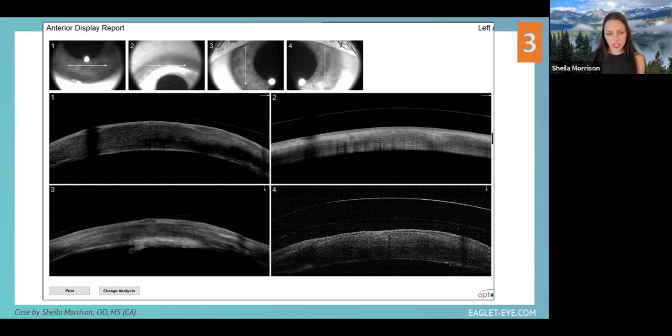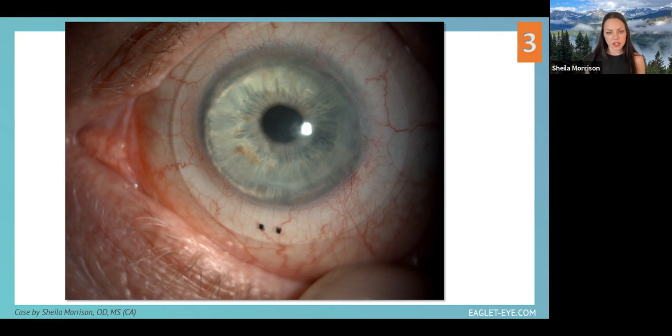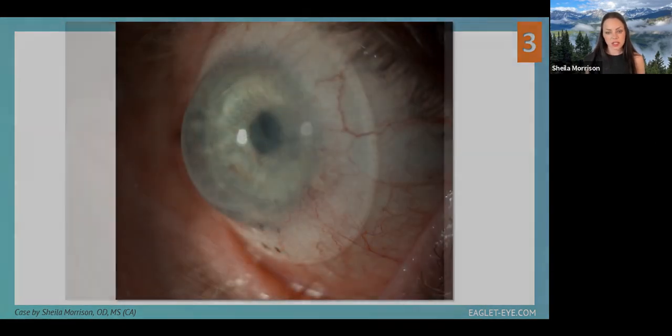Now, data-driven, again, ESP, with this patient we just had to go with a fenestrated freeform design. On the first or second lens, this was an iFit lens, and it was just amazing. So I'm going to cut to the chase: data certainly worked for this patient.